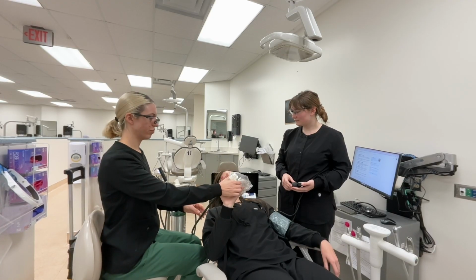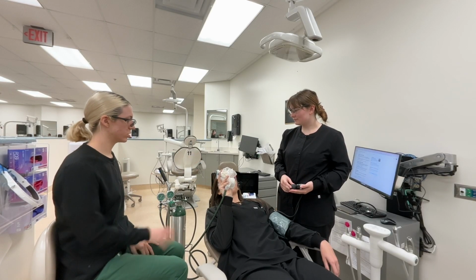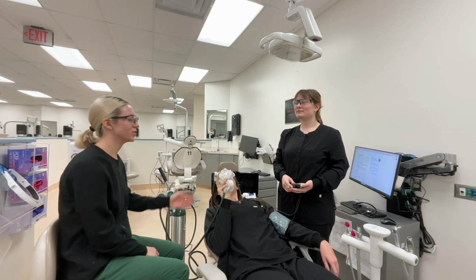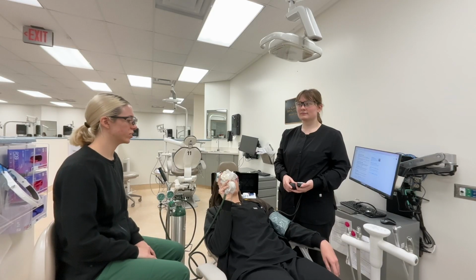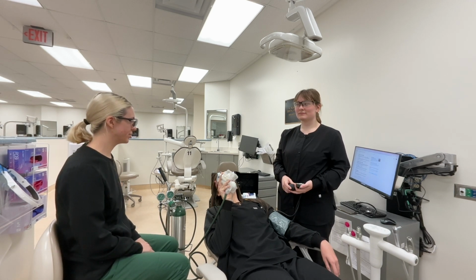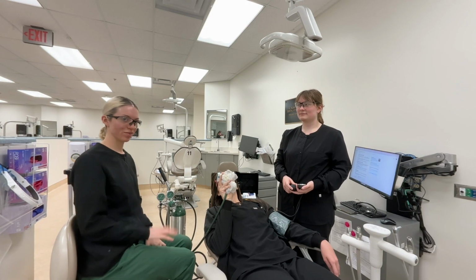Oh, hold it. Okay. I'll give it to her. She'll just place it near her face, and we'll just let the supplemental oxygen get her oxygen levels up a little bit more. And then, of course, if she were to go unconscious, me or operator 2 would just put it over her face. We would probably lay her down supine and put it over her face and administer oxygen, emergency gas. And then, if she does not feel better or she passes out, we'll just have to wait for EMS to come and further help the patient.